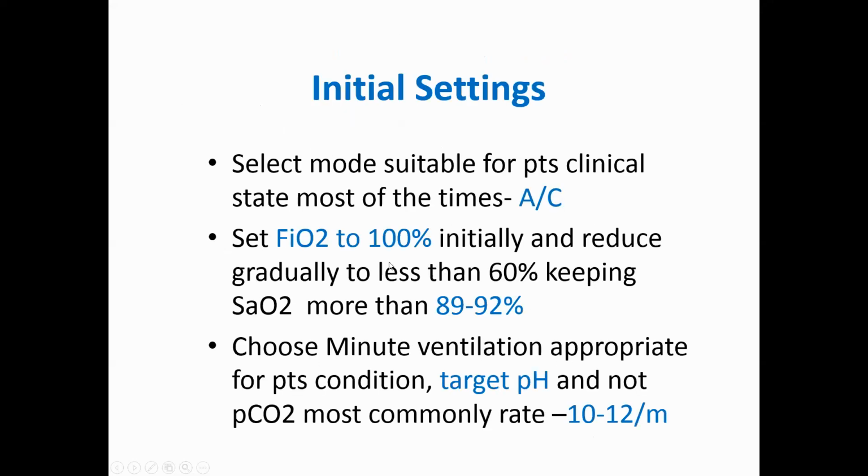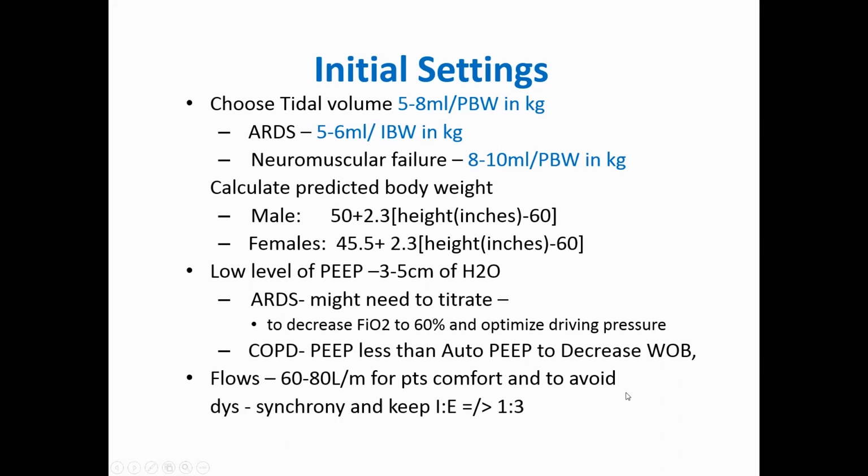You do this, and these are your goals. Actually, every time you put someone on the ventilator, you set the goals in your head. This is what you want to achieve. For target volume, although 6 cc's per kilogram is what we have been recommending for a long time, last week or 2 weeks ago in the Blue Journal or the Annals, it was stated that 6 cc's is not going to work for everyone. What you have to do is decide whether 6 cc's is right.